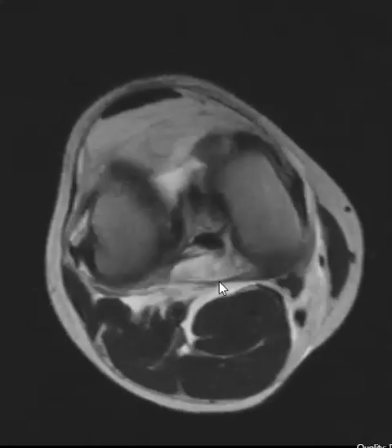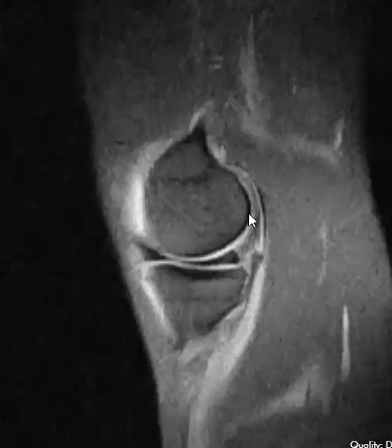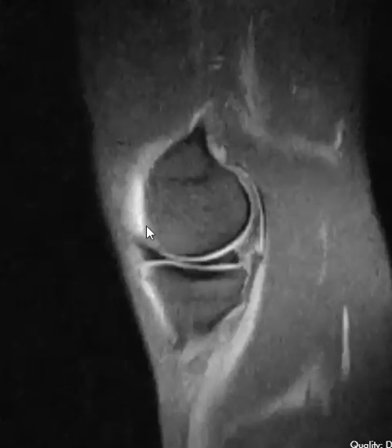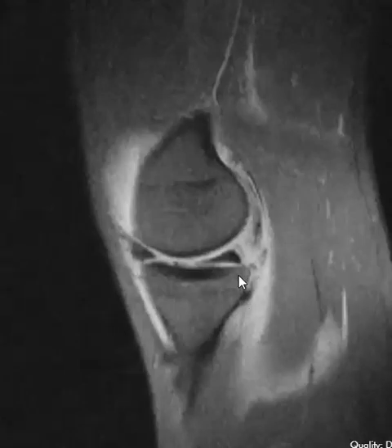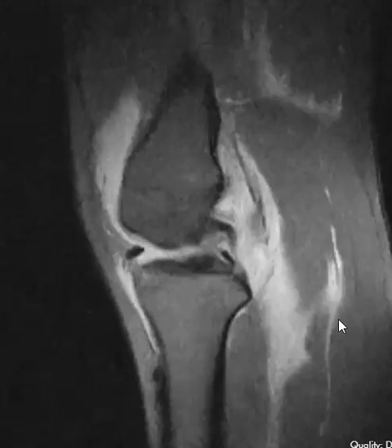We're going to try to confirm that on another sequence here. This is a sagittal PD fat-sat sequence. Luckily the menisci were good. This is the medial side — medial femoral condyle, medial tibial plateau. The anterior and posterior horns are looking good. If we go towards the central part one cut, we see here it is — a ruptured joint capsule. You can see this gap right here. You can see fluid from the joint coming out, going back here through the soft tissues.